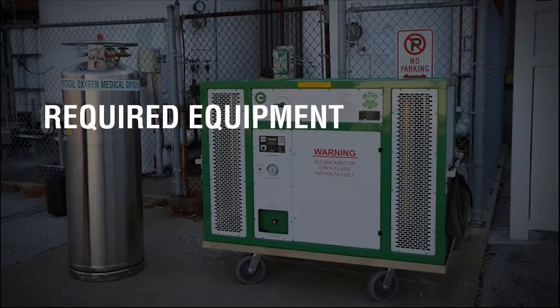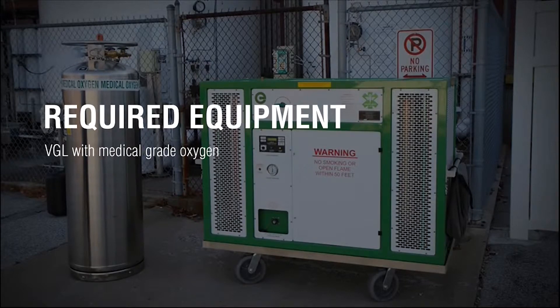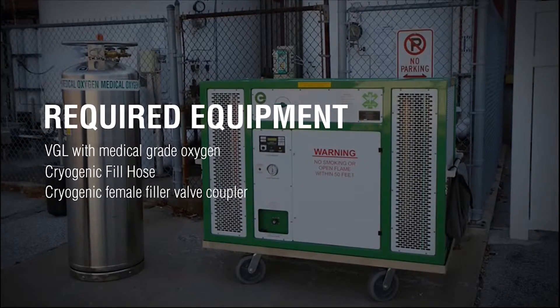In order to fill the MODS, you will need a VGL with medical grade oxygen and a cryogenic fill hose with the Essex Cryogenic Female Filler Coupler on the end.